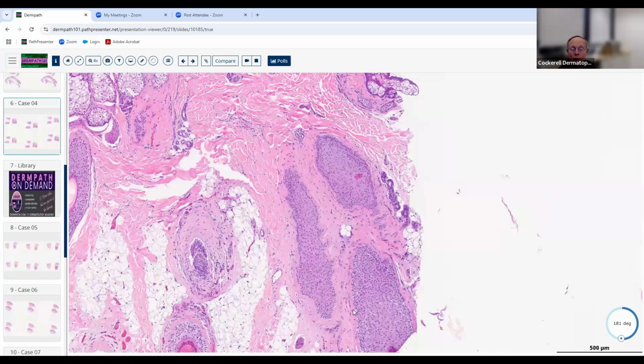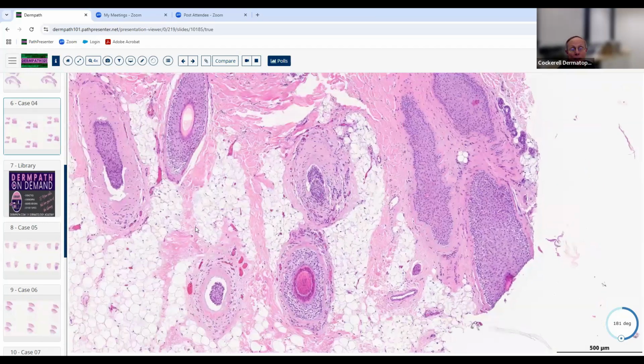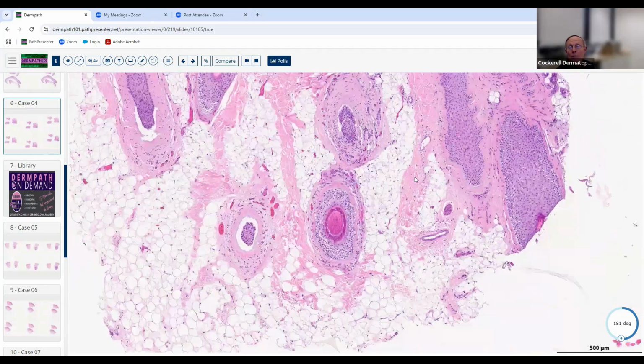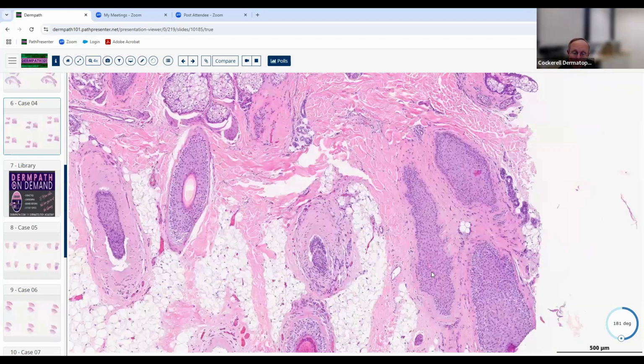Now, we can tell, even looking at this follicle, that this is not likely to be alopecia areata for a couple of reasons. That's a harder question to answer, but one reason is that if you get alopecia areata, usually if there are catagen follicles, they're all in catagen at the same time. So the same stimulus comes in and causes all of them to go into catagen at the same time. And that's why the hair shafts all get shed in that one little area, all at the same time.